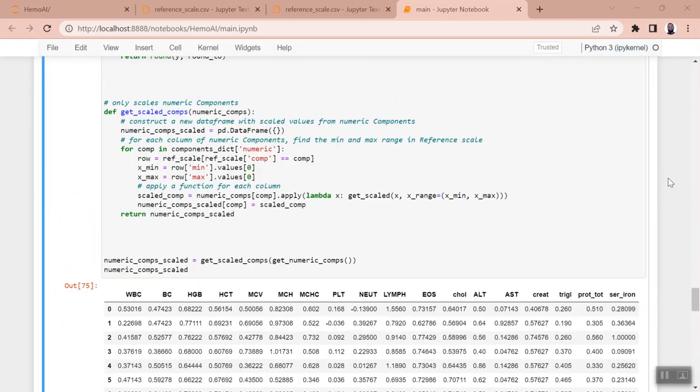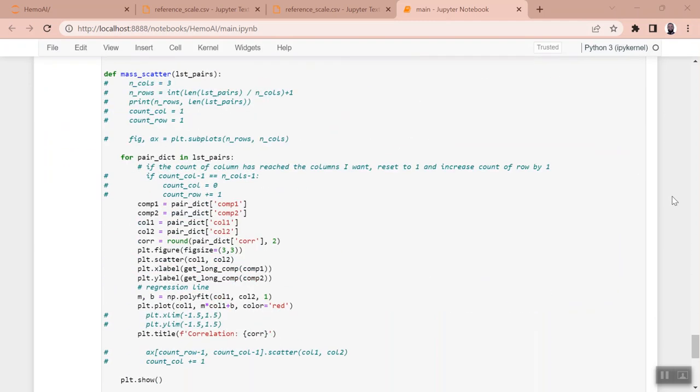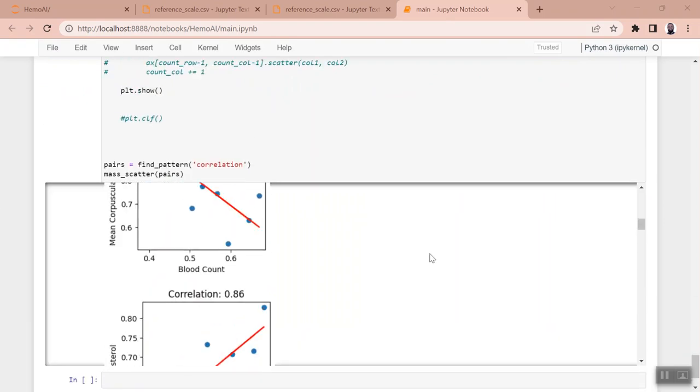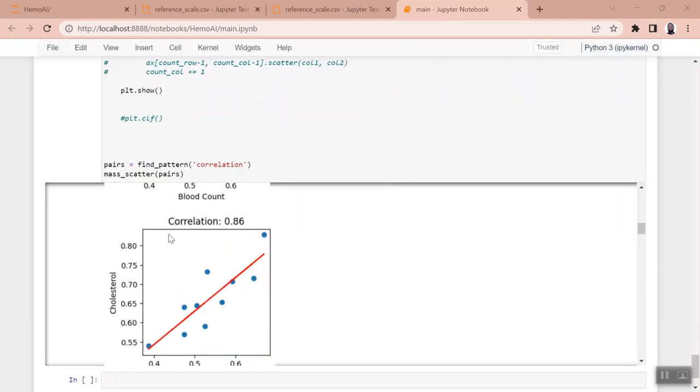So I scaled this because I wanted to see not only with my eye, but also because it's easier to compute values when everything is scaled from 0 to 1. So of course, the user experience is going to improve, hopefully. Okay, and here I have plotted our regression line.